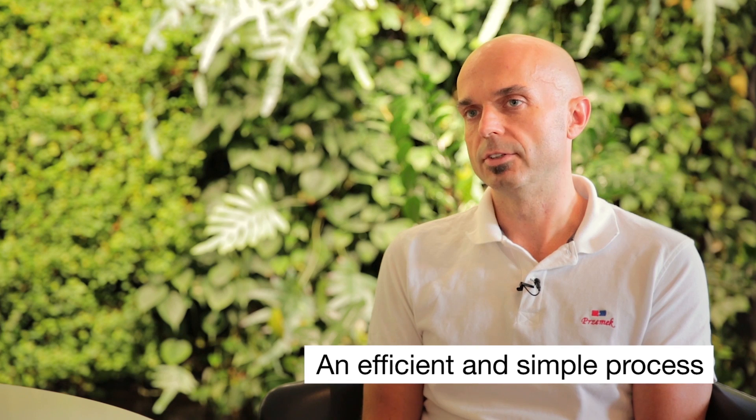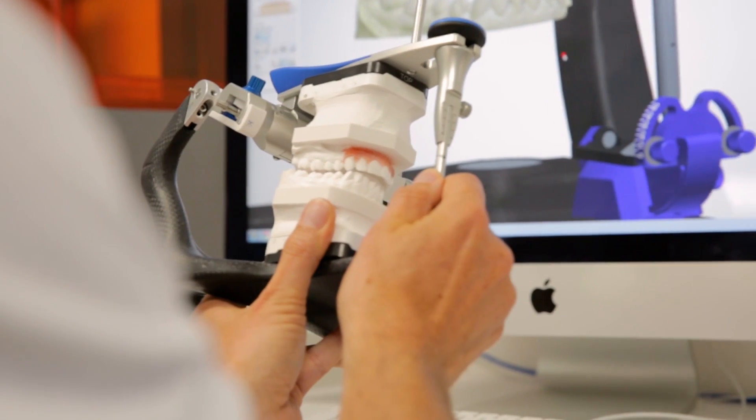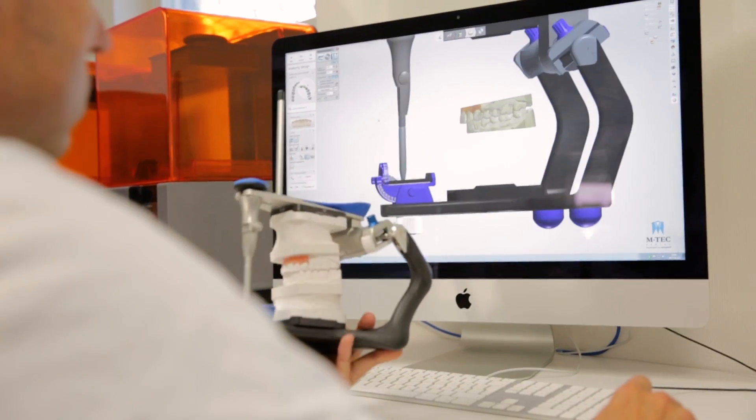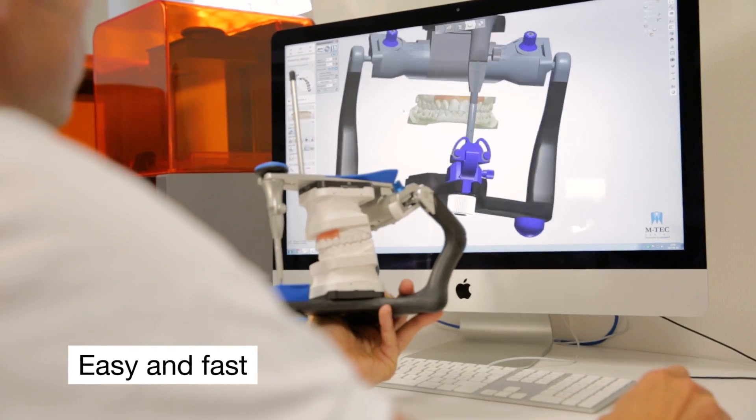The process itself is very efficient and very simple — anyone can do it, basically — because you don't have to think about it after you calibrate the scanner. It does everything by itself. It's very easy, it's very fast, and it lets me move the physical models into the virtual world in a very accurate way.